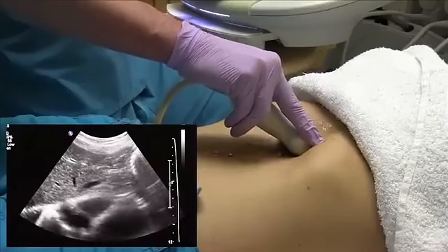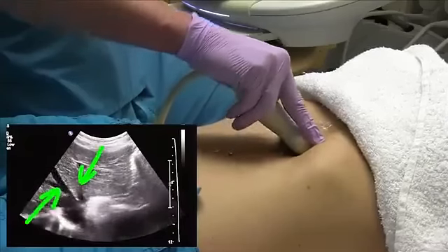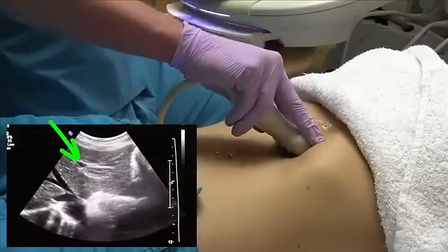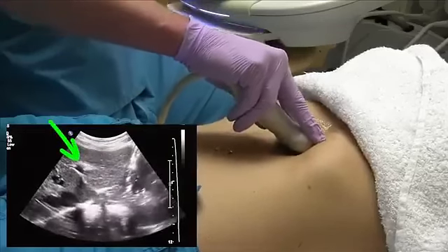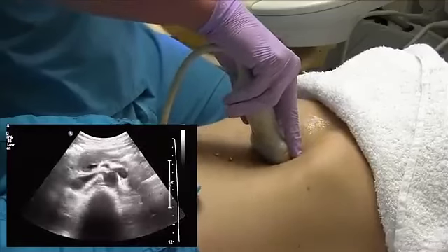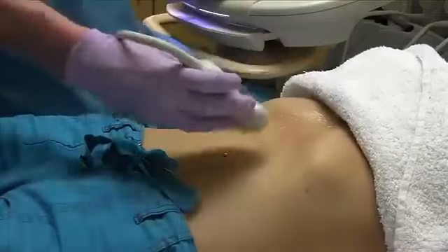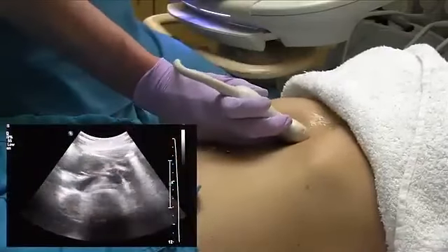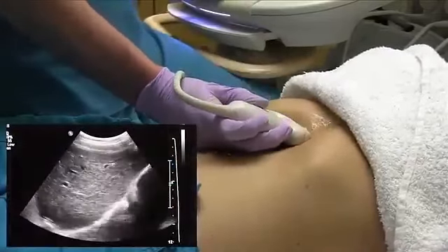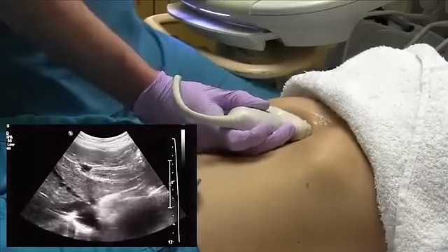Coming down, you'll see the hepatic veins. And then last, you're going to see the portal veins. And you sweep all the way out of the left lobe here. You want to make sure you're sweeping through every organ, because if you don't sweep, you probably miss some anatomy and possibly some pathology too.